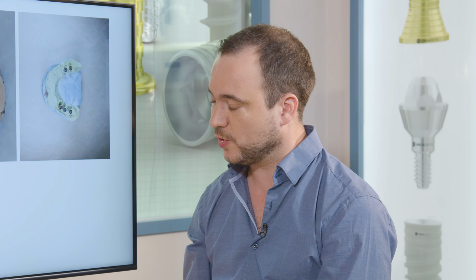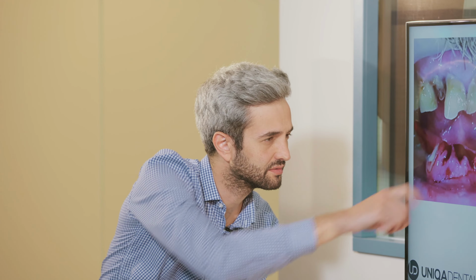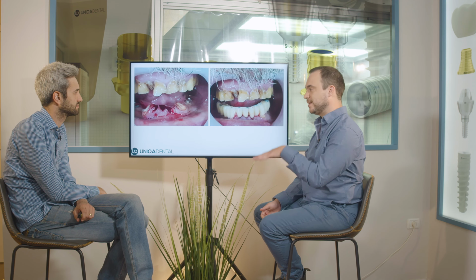So we can add some implants in the frontal area. In most cases, you have place in the frontal area for at least 2 implants. So you can have something temporary for the patient so he can restore his aesthetic and functional aspects. Now you can add a couple of implants in the frontal area and you'll have a good cross-arch bridge with 12 units on 3 implants on one side, 2 on the other, and 2 frontal implants. Are these the canines? Yes, we took part of the canine, so the bridge will have some support.